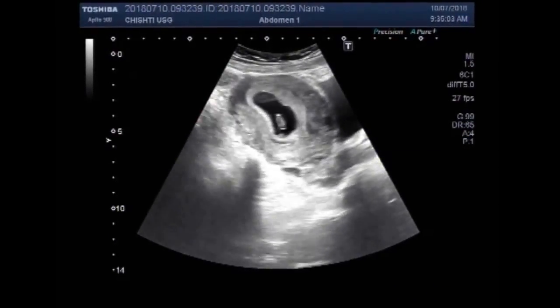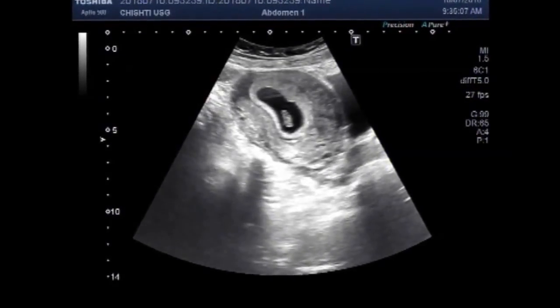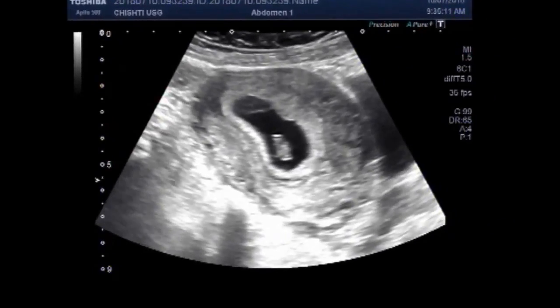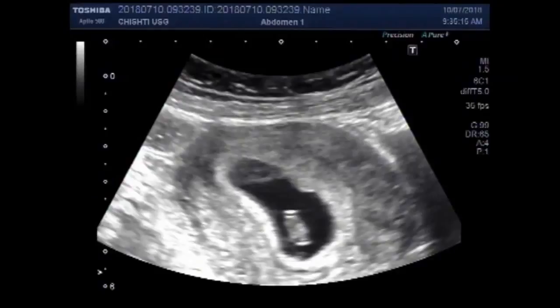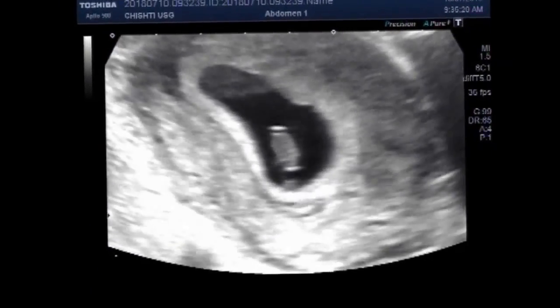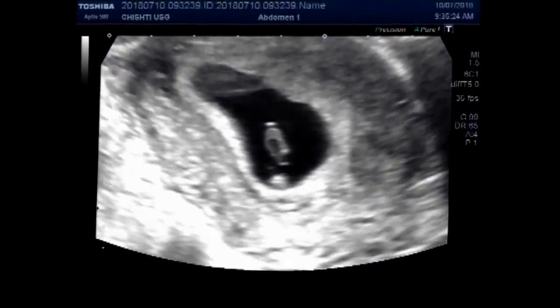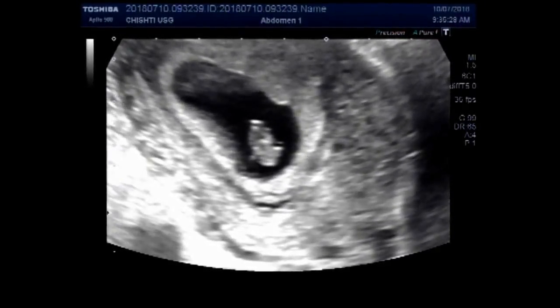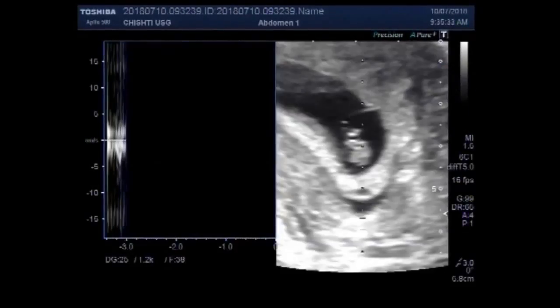Now you can see a small early pregnancy. You can see a tiny embryo in the gestational sac having fetal cardiac activity.